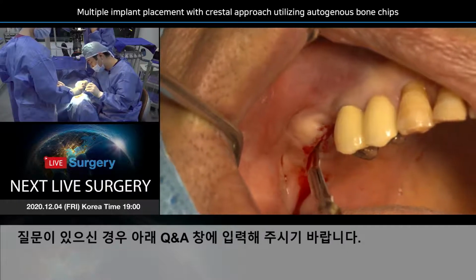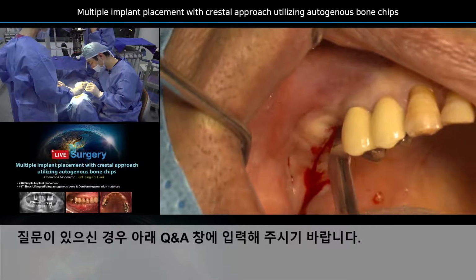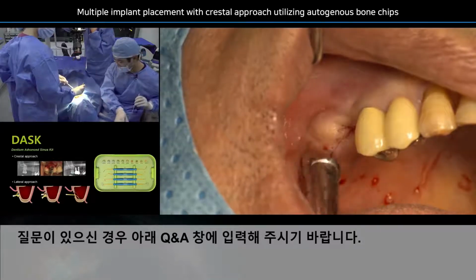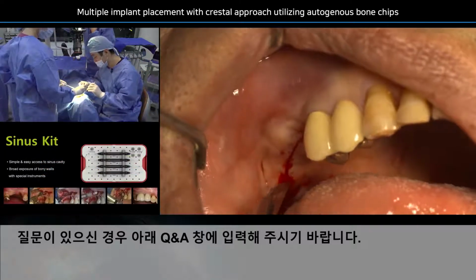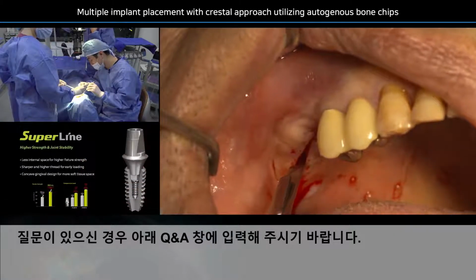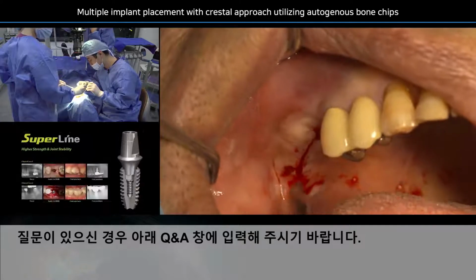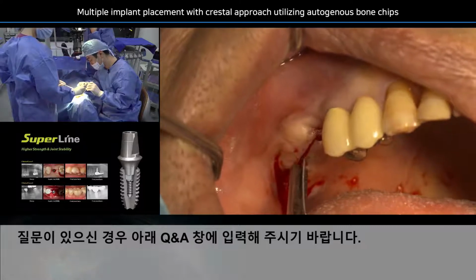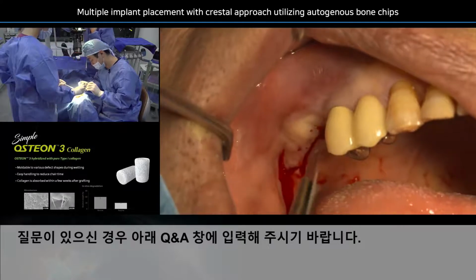And always you have to go for the pizza cut. You have to touch the bone and then properly place the incision. At the end of the mid-crestal incision, I go slightly 120 degrees. It's not a vertical incision, but it's kind of a horizontal and vertical incision. We call it the cut-back incision. So this is the cut-back incision. It's going to help us to properly see what's going on under the flap.